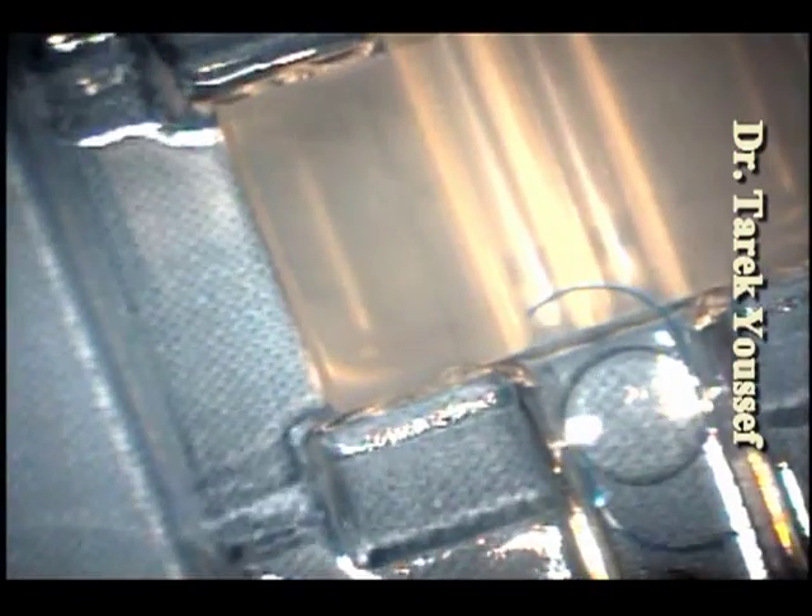Hi, I'm Dr. Youssef. I'm going to show how we avoided the scratches on the intraocular lenses — the Tecnis acrylic three-piece lens, the ZA9003.